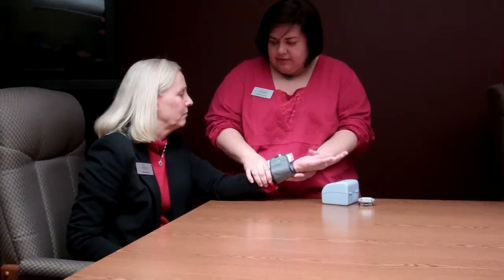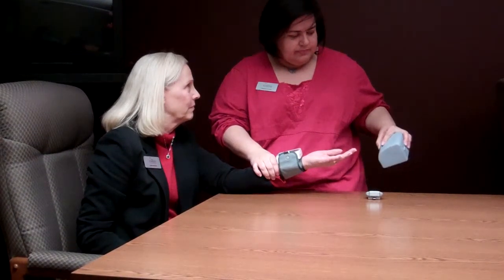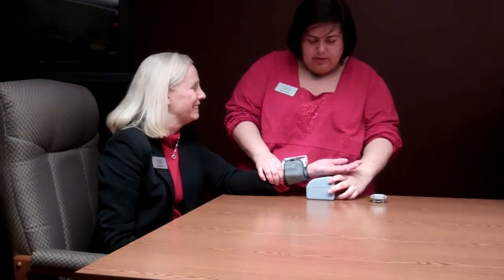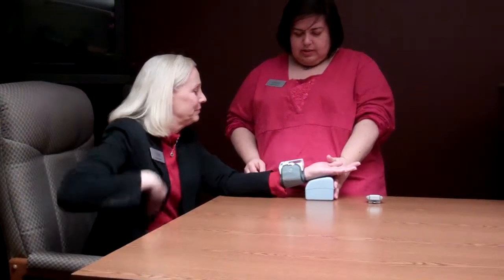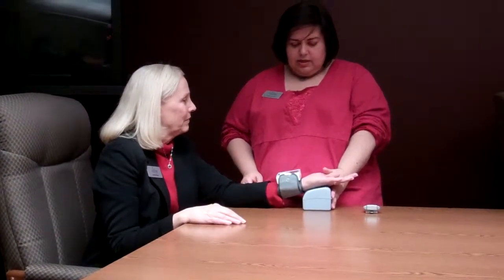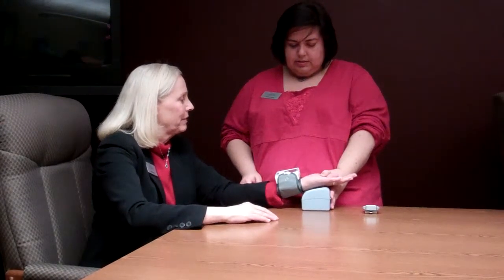You want it to be at heart level. Linda's sitting down and they designed the carrying case for this to have a little cradle so she can rest her hand there. Linda would be able to operate it on her own, hitting the power button and then hitting the start button to start pumping it with air.